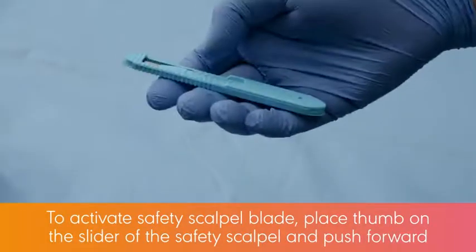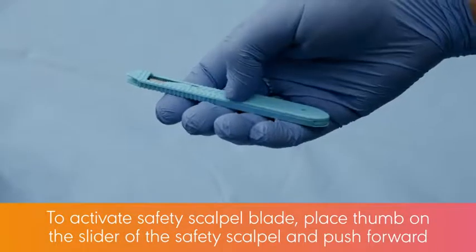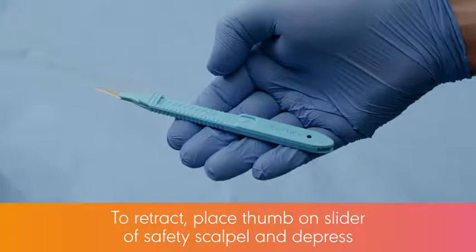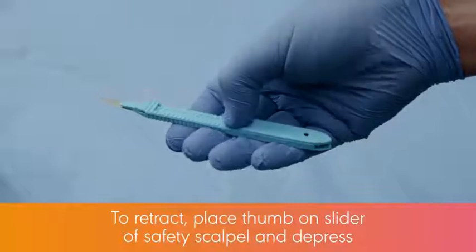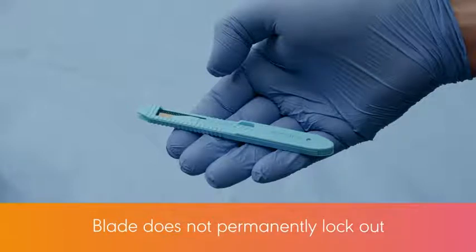To activate the safety scalpel blade, place your thumb on the slider and push forward until the blade locks into place. To retract the blade, place your thumb on the slider and depress. The blade will automatically slide back into the retracted position. The blade does not permanently lock out and may be reactivated as desired.